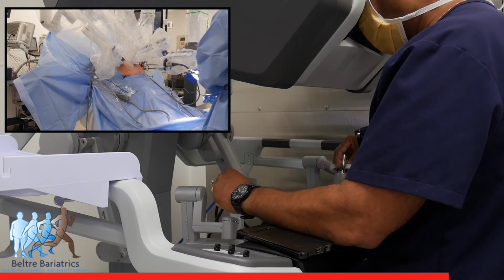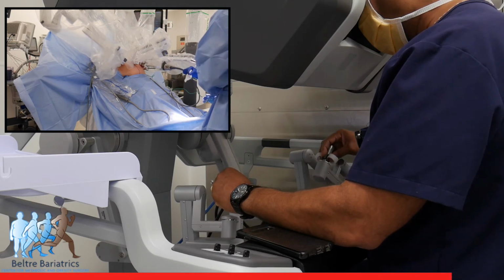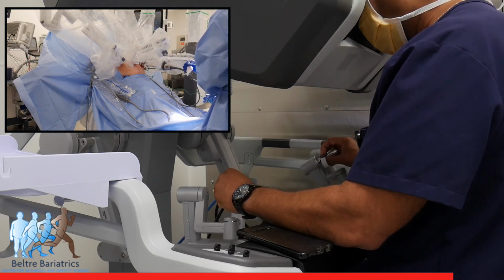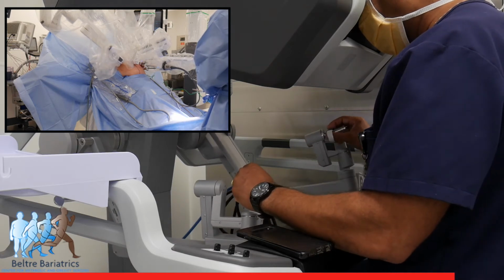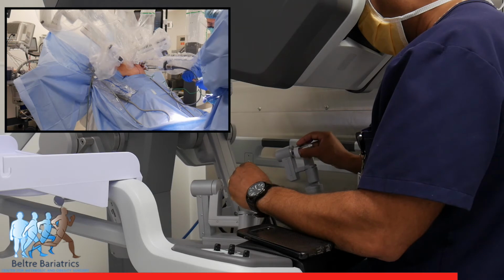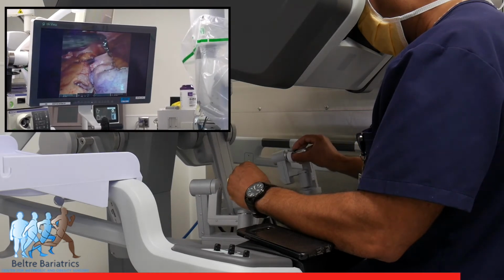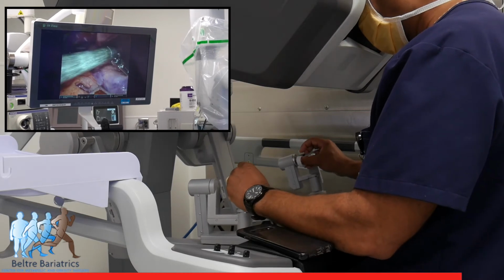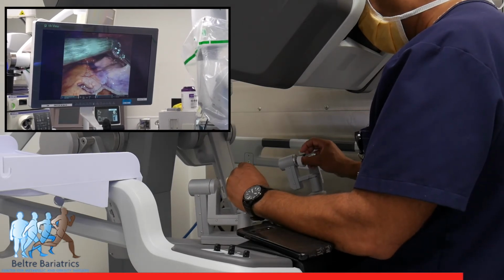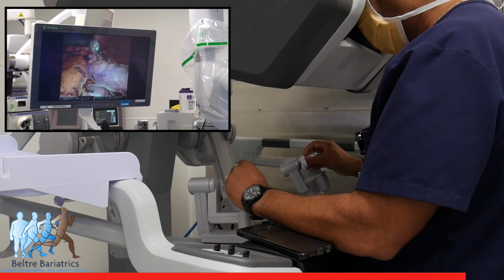You can see how the robot kind of imitates my movement up there. You can see on the upper screen. So every little movement that I make, the robot also makes very precise. So these are very precise, calculated movements. I can suture. I can do anything that I need to do that you do in normal procedure. That's a robotic arm.